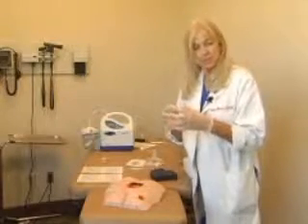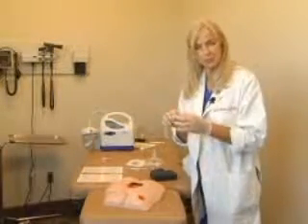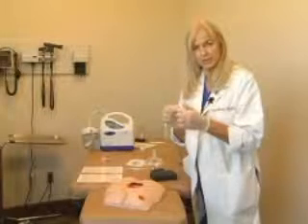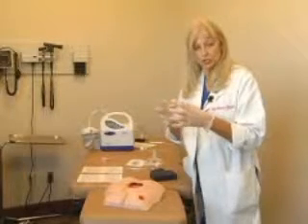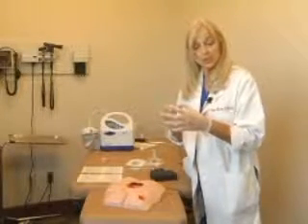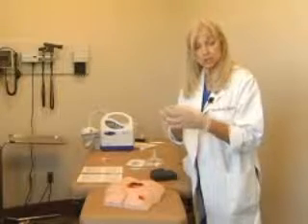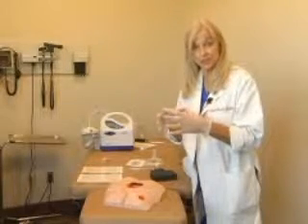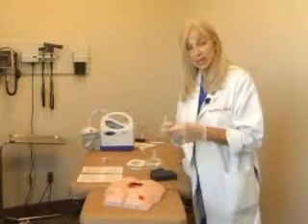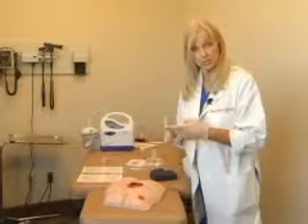Sometimes in dressing, if the wound is very small and you have a reduced amount of airflow, you can occasionally get a closed system alarm. To alleviate the closed system alarm, we need to increase the surface area of the wound filler, and we'd like to demonstrate a couple of ideas to resolve that.